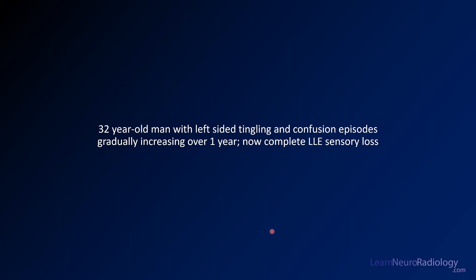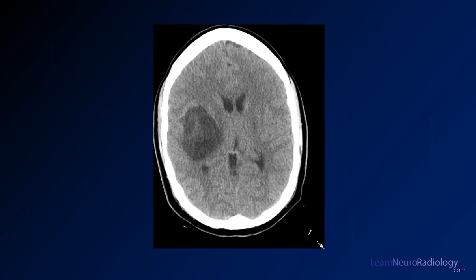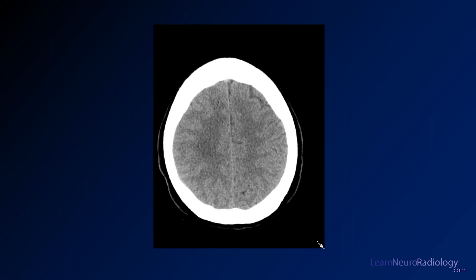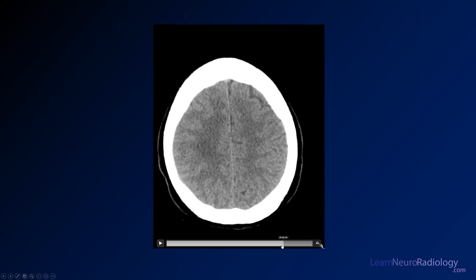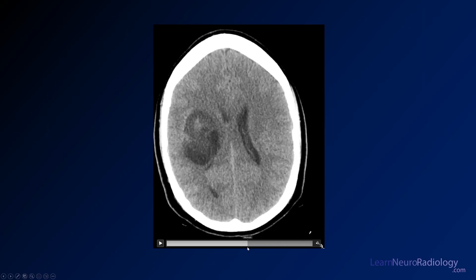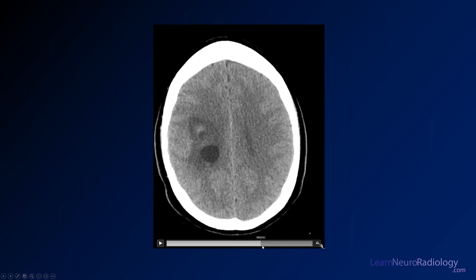Let's move on to our second case — a 32-year-old man with left-sided tingling and confusion episodes increasing over a year, now with complete left lower extremity sensory loss. Here we have a CT to scroll through. You can see that the right cerebral hemisphere is expanded, with a kind of ill-defined mass. Some margins are pretty well-defined, others more ill-defined. In the center there's a little bit of hyperdense material — possibly calcification or blood products. Near the top there's a little cyst formation.